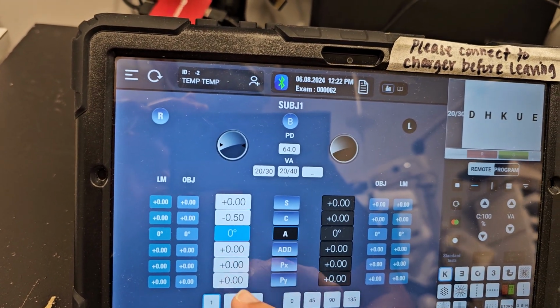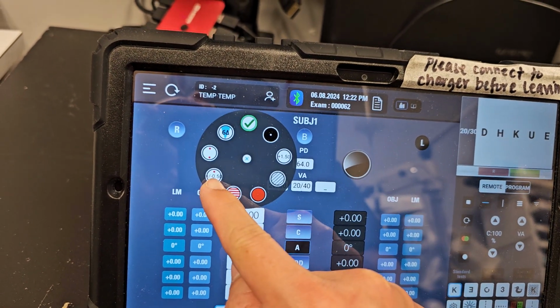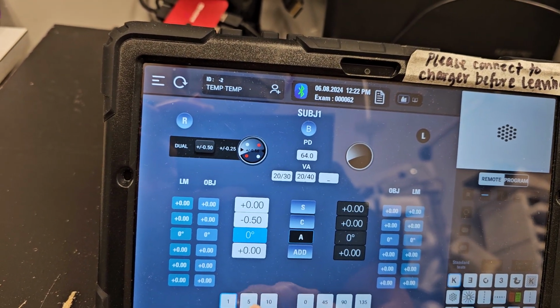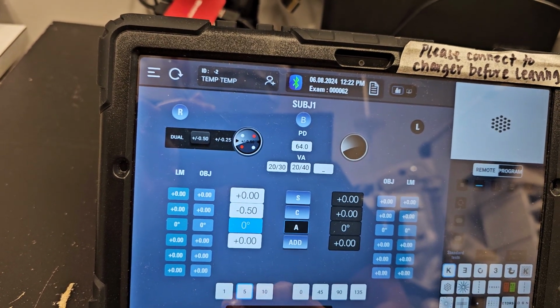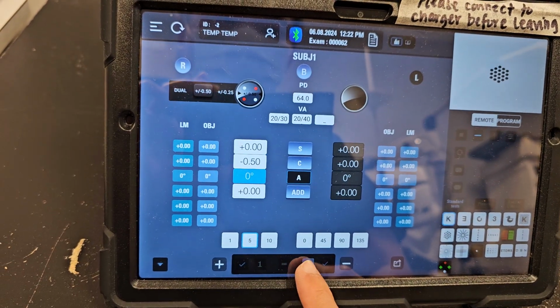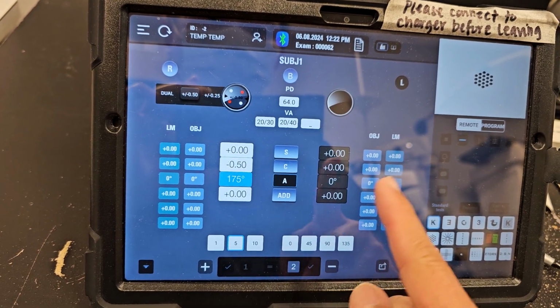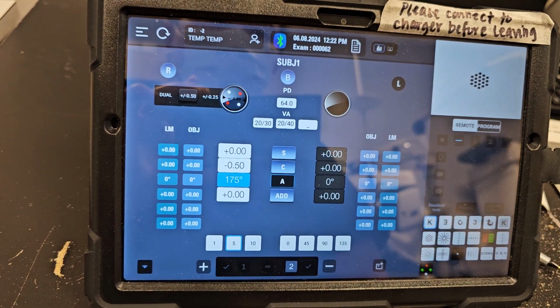And when you're refining the axis, you can use the plus minus JCC function here, and then you can do 1 degree, 5 degree, or 10 degree increment, and you ask the patient better 1 or better 2, and if the patient selects 2, you click the check mark next to 2, and you will switch accordingly by the increment you specify.